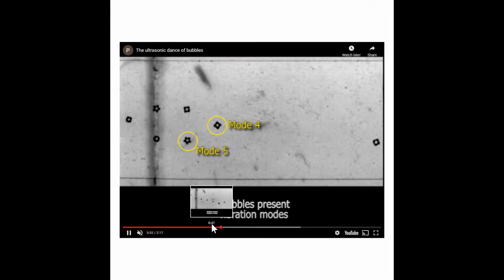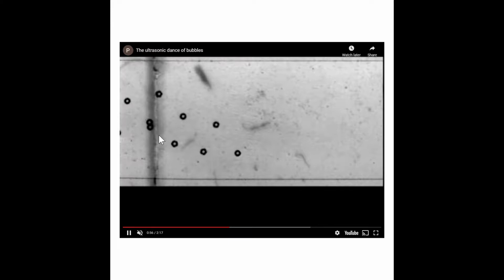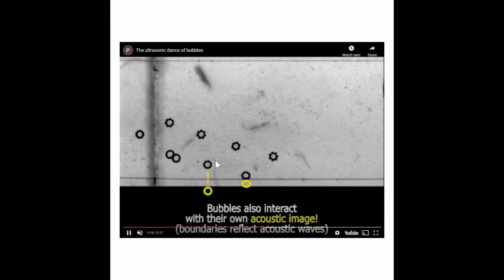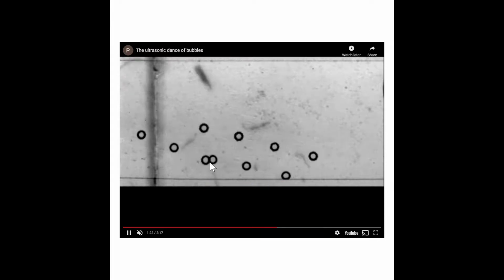In this video, I just want to play you a little bit of a clip of it, just because you have everything linked in your workbook if you want to see the whole video. This is a video of little microbubbles going under an ultrasonic field, and you can see as they breach this part, they're very round, and then you start to see them contract and expand. And then they get these funny little lumps on them. So this is that resonance that's occurring. It's that unpredictable behavior we are seeing. It's very interesting to be able to see the walls contract and expand as they are introduced to that ultrasound beam.